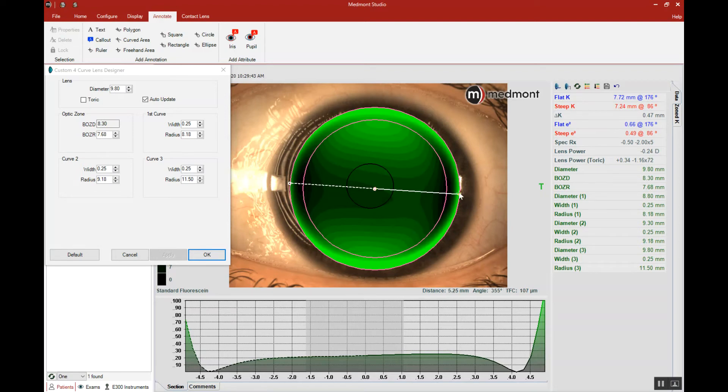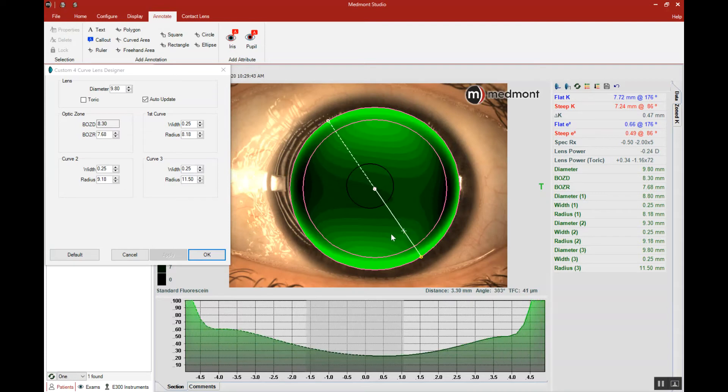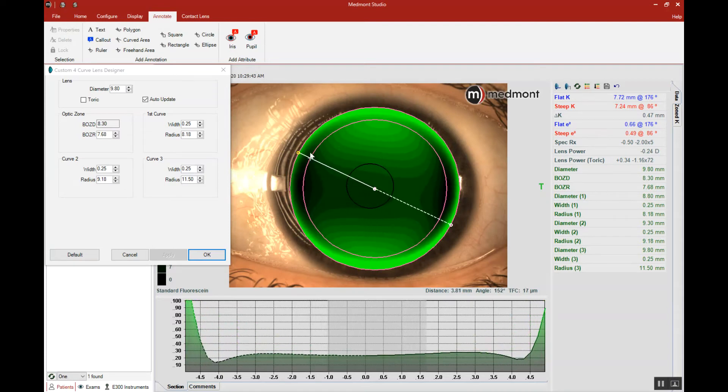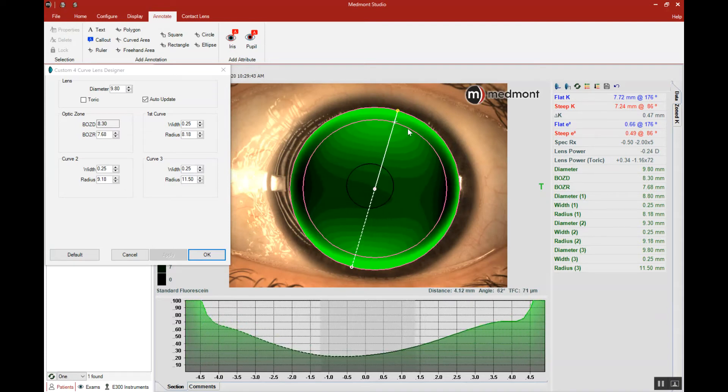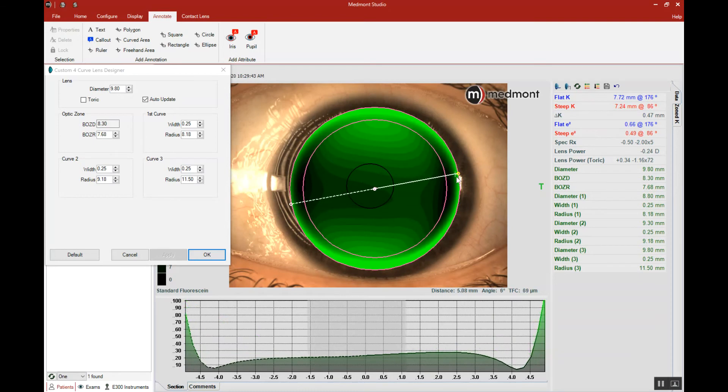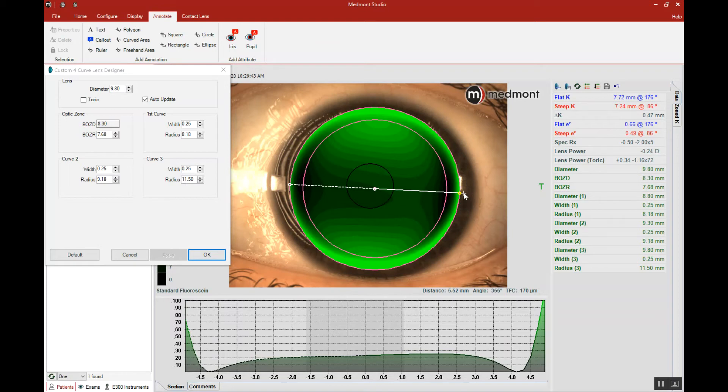Let's determine by moving this axis line around what axis the lens finds its landing with the peripheral corneal surface. And of course, on a with-the-rule cornea, that will be across the horizontal meridian, and we see that here. Landing at nine o'clock, landing at three o'clock.